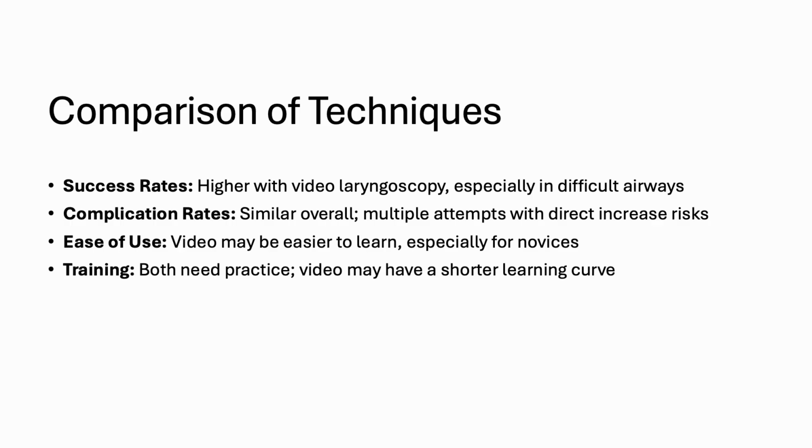Comparison of techniques. Let's compare these head-to-head. Success rates for first-attempt intubation are generally higher with video laryngoscopy. Studies show it shines in difficult airways. Complications like severe hypoxemia or hypotension are similar between the two, but multiple attempts with direct laryngoscopy can up the risk, as each try stresses the patient more.